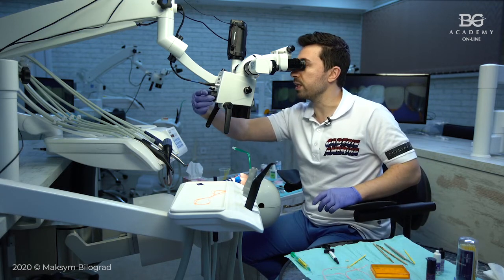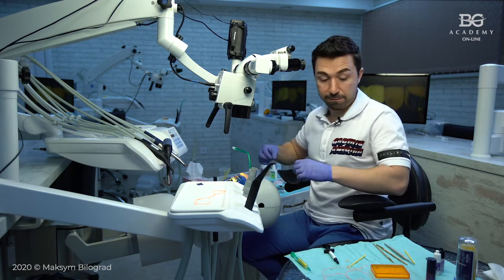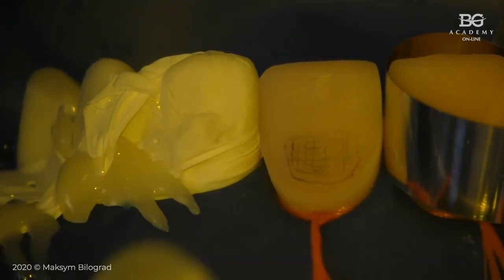So I'm using now a brush, and I will put adhesive both on the tooth surface, filling surface, or exposed dentin surface, or if it was an all-enamel case, I will use bonding agent. We have to. So we'll put some bonding agent on the tooth surface, and also I will take my veneer from ethanol. I will dry my veneer from ethanol.